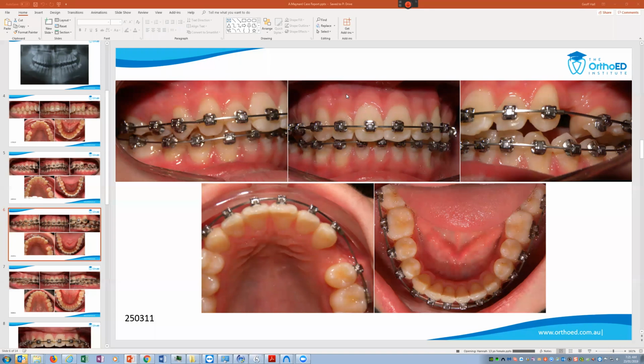I'll just ask a simple question. Why have you got those crimp stops on both 3s? Because when you deal with self-ligation brackets, there's not much friction in the bracket system. When you tie in with elastics, there's a lot of friction, and I'm going to go through this with you in the next module. When you use self-ligation brackets, there's not much friction, so the wire can actually slide around.